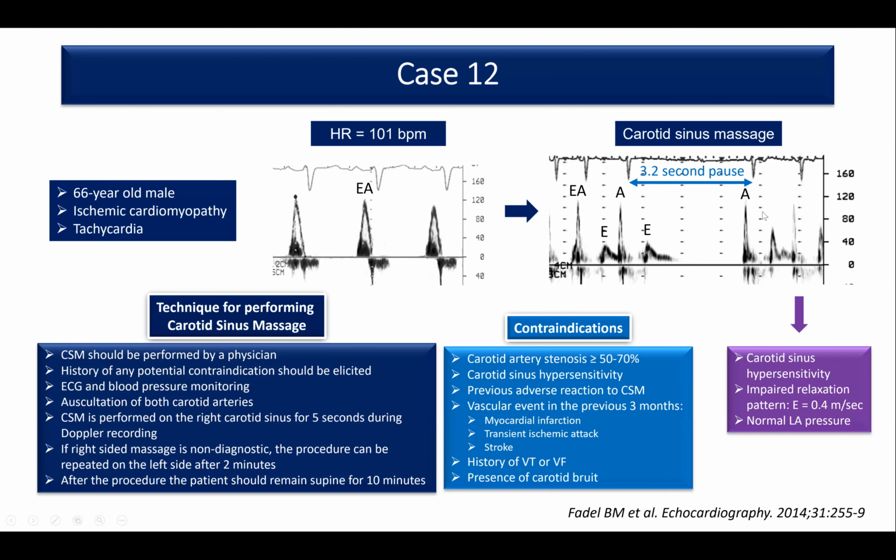So you have to be careful once you do carotid sinus massage. You need to know the technique, how to perform it. You need to know the contraindications. I'm not going to go through them. But here the massage was helpful for us. Why? Because the patient went from this pattern into this impaired relaxation pattern. So we knew that this patient has normal filling pressures, that's one. Two, we know that this patient has carotid sinus hypersensitivity. We made 2 diagnoses at the same time in this patient.